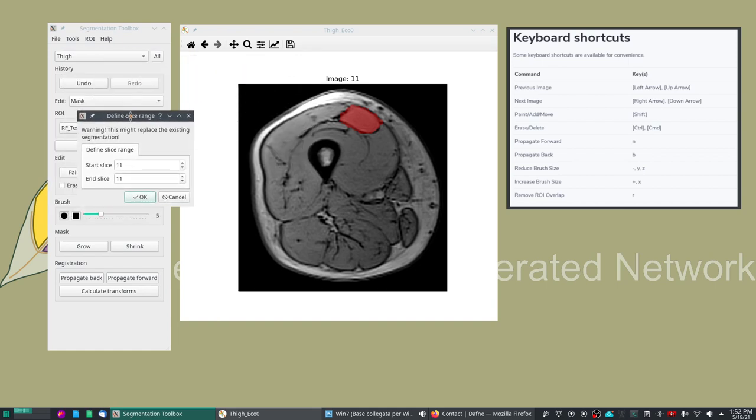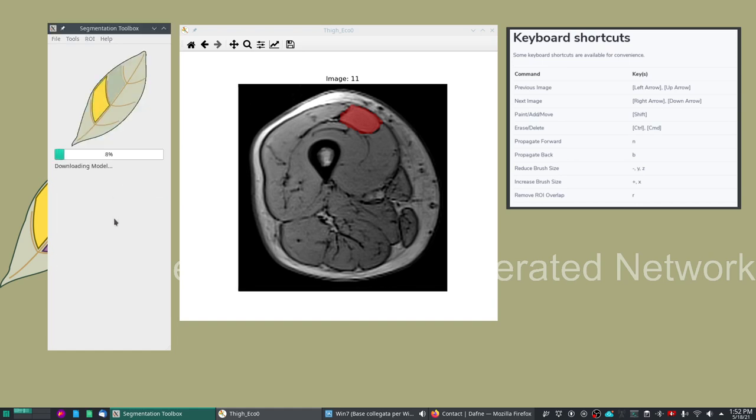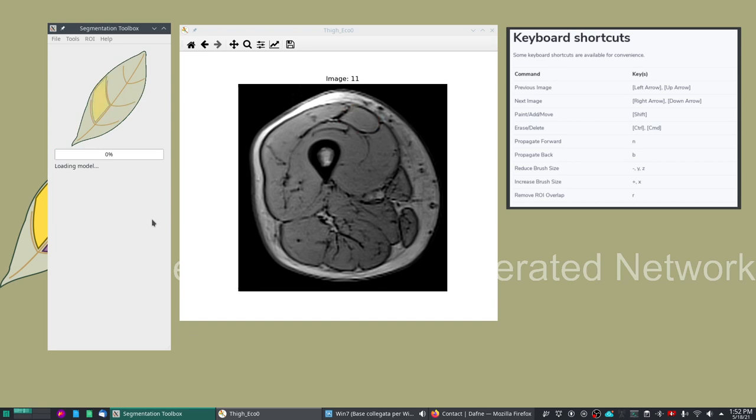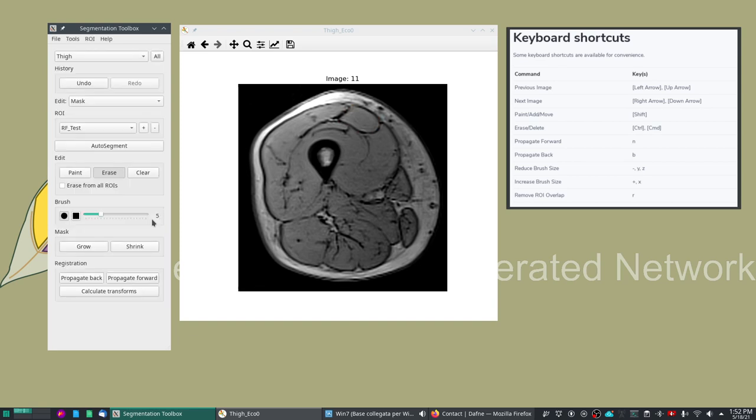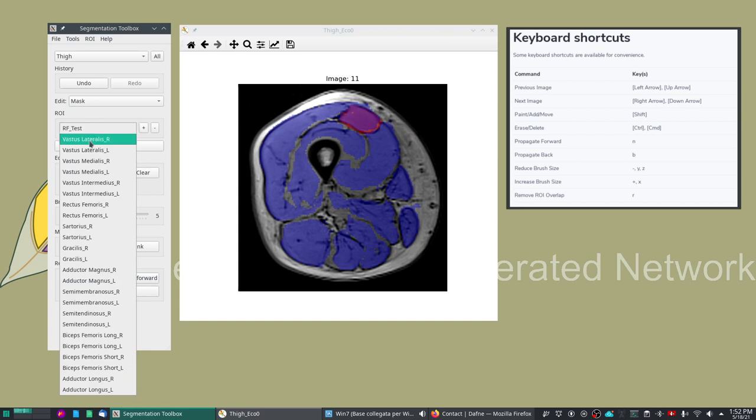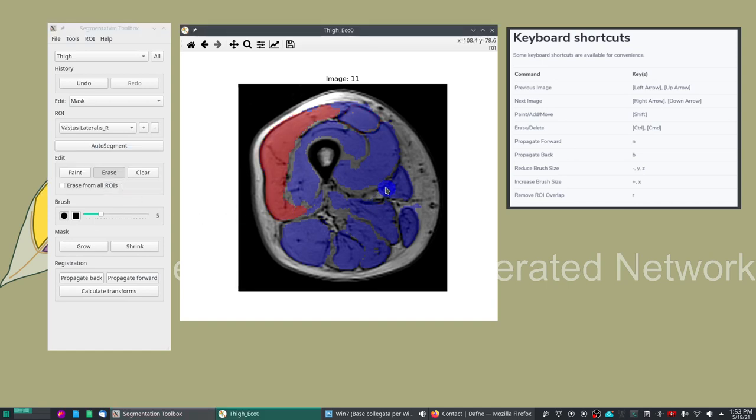Now we can click auto segment and this will replace the existing segmentation. If you have done some previous auto segmentation and modification, just clicking here will replace it. We'll just do it on one slice. You can select a slice range here but let's just do it on one. Now there is a new model that is being downloaded, receiving it from the server, and then it will load it in memory and run the segmentation. We still have the RF test here, we can delete it because we don't need it anymore.